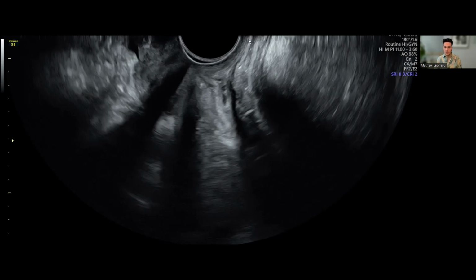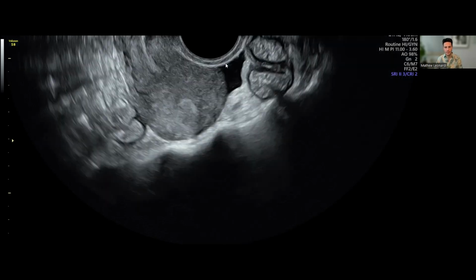This is the lumen. Here's mucosa, anterior and posterior, and this is the anterior wall of the muscularis layer. Just on this side of it, we have the rectovaginal septum, so it's going to be this region here, and this is their vagina that's still splaying as we're pushing the probe in. Our urethra is going to be in this region right about here.